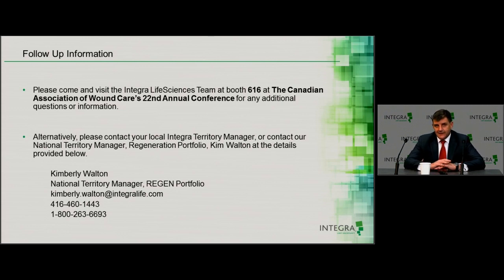For IDRT, our protocol is fundamentally put on as an outpatient. We wrap it all and we write all over the outpatient dressing, do not touch, do not change, and we change it in 1 week. We don't let anyone get to it.